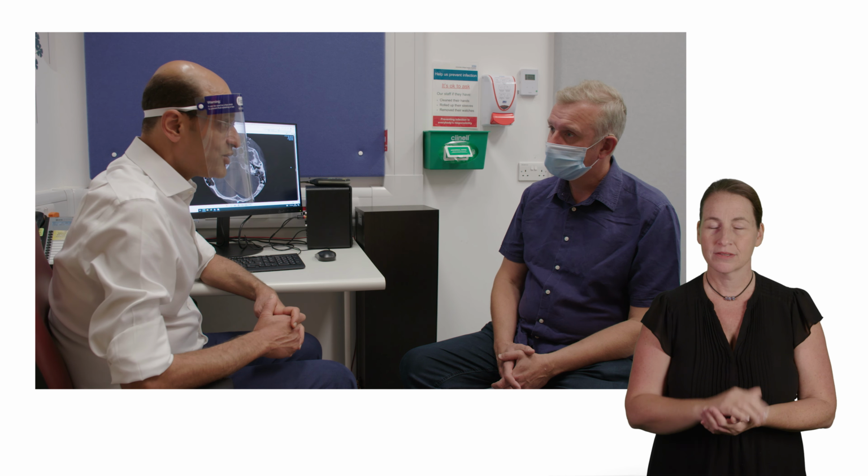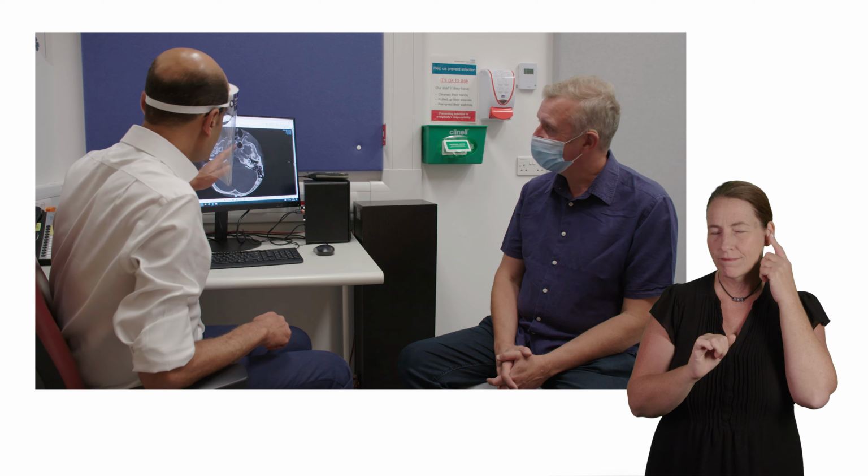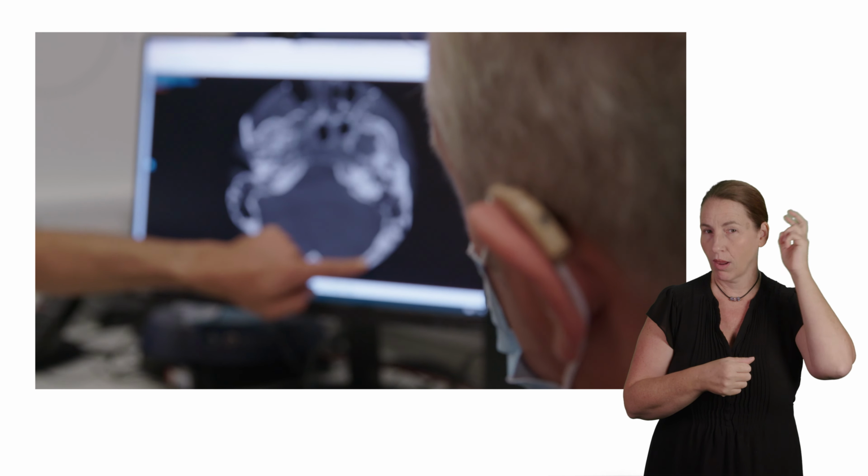And I'm happy to tell you that we would be able to help you with a cochlear implant. That's really fantastic news, thank you. We think as a team that your left ear would be more suitable to receive the cochlear implant.